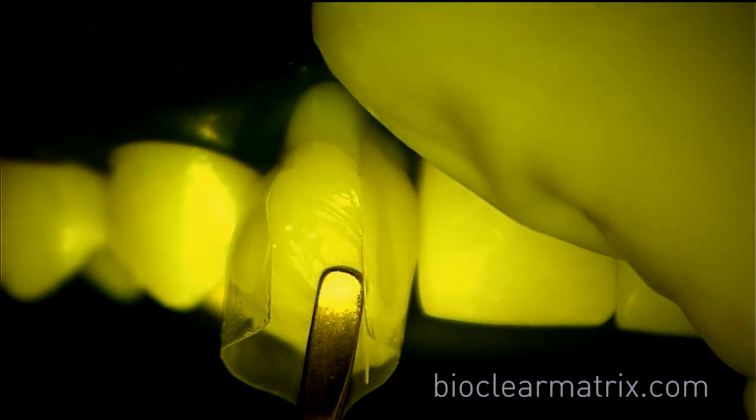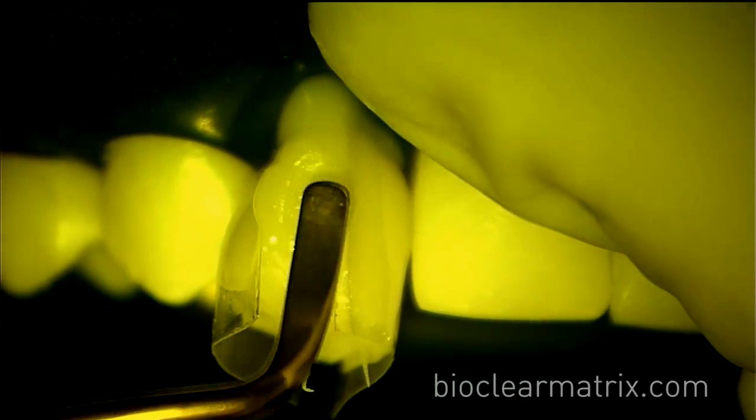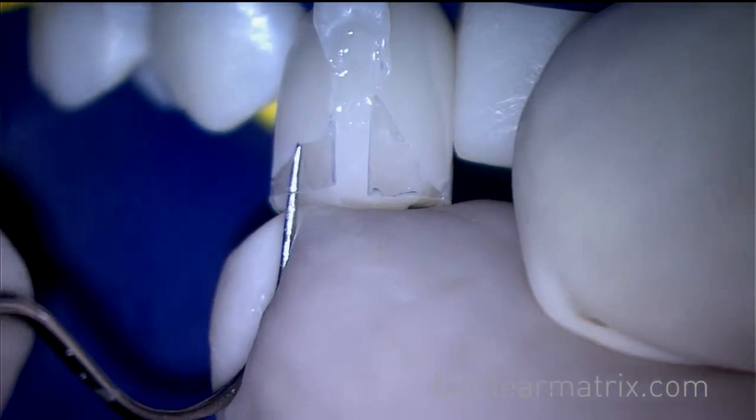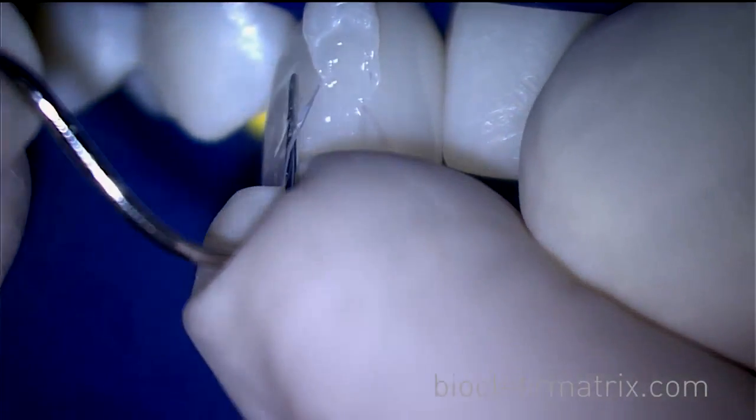An instrument is used to give general shape to the uncured composite. Use brushes to remove excess flowable in interproximal areas. Make any adjustments, then light cure. After light curing, use an explorer to release the matrices from the tooth.